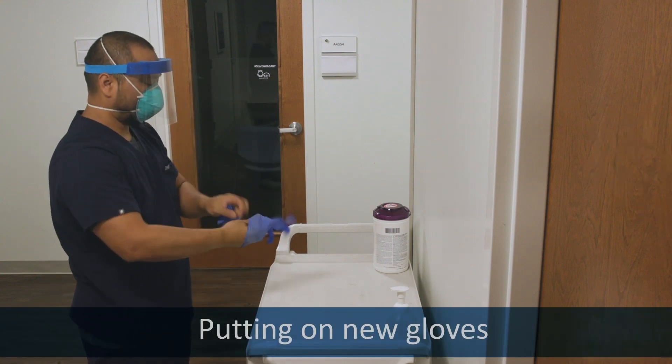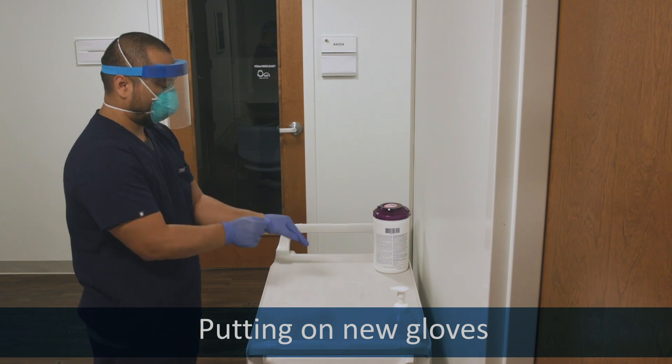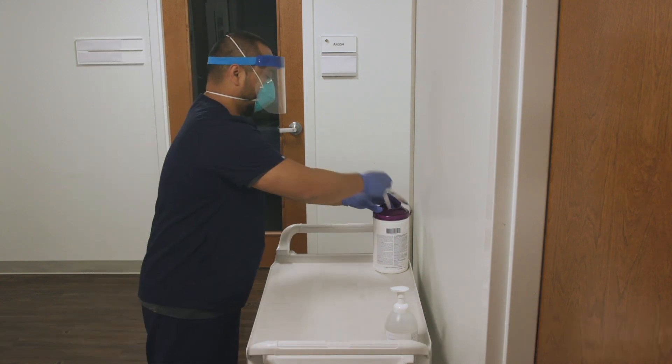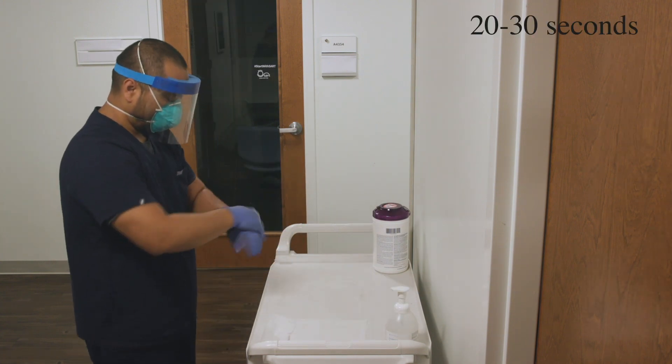Put on a new pair of gloves. Use a disinfectant wipe to create a clean mat. Sanitize your gloves.